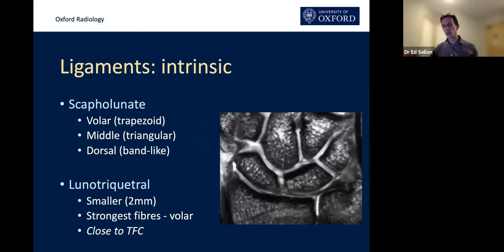Then you scroll anteriorly and posteriorly to look for the dorsal and volar bands, and change to axial images to look for those bands. This is where thin-slice 3D imaging is so helpful. A year ago I'd be happy with one-millimetre slices; now I want 0.2 millimetres. In most departments you might get just one axial slice lined up through the joint — you really need two or three slices through the ligament to make a proper decision.